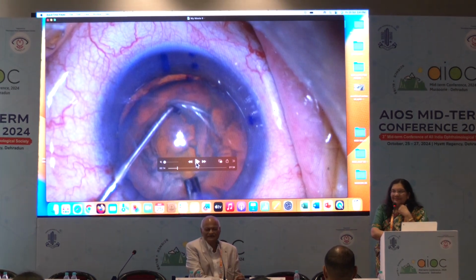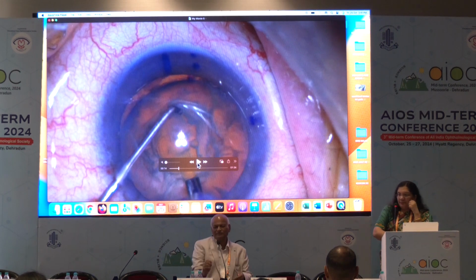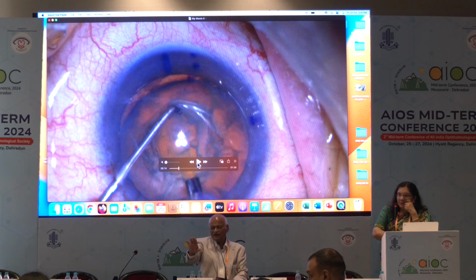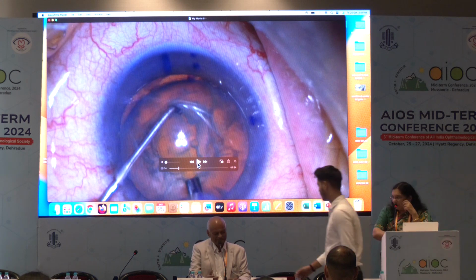After the CTR, what will you feel? Is it possible now, after putting the CTR and stabilizing the capsule, to do the phacoemulsification? You are very correct.